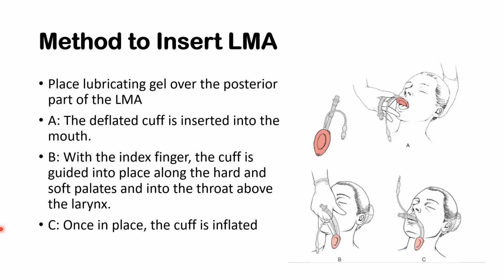You insert, it's not like an OPA where you insert it opposite. You insert it how you want it to be placed. You want it to sit like this. So you have to insert it closely, we want it to fit snugly against the palate. Then you use your finger to push in.